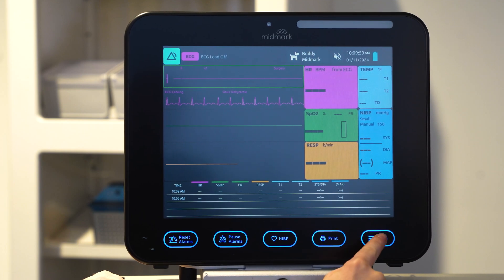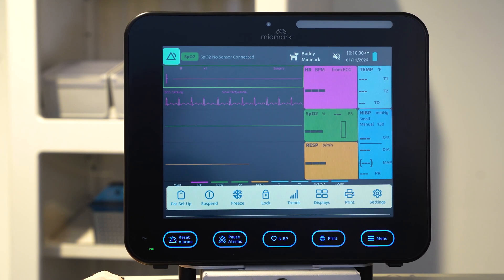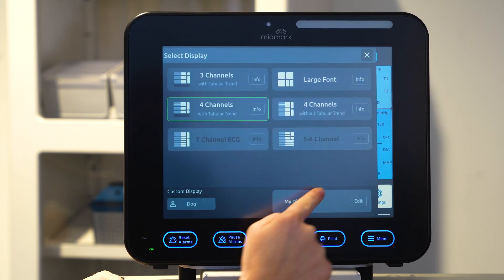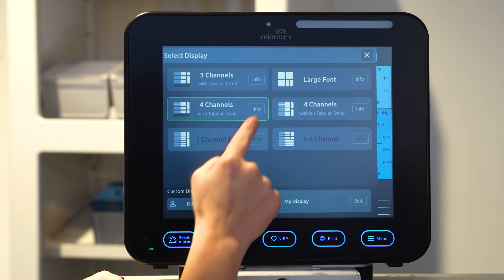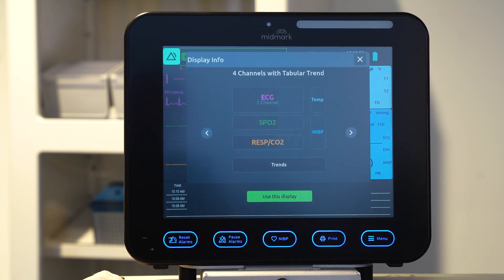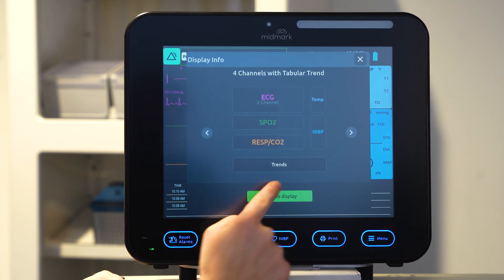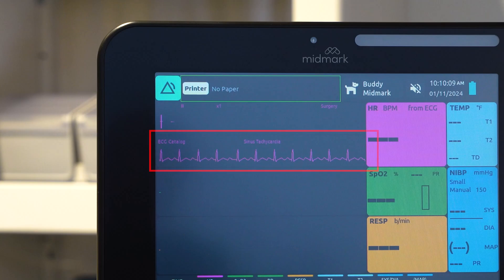Select menu, then displays. Select a display with four or more channels to show the ECG catalog.